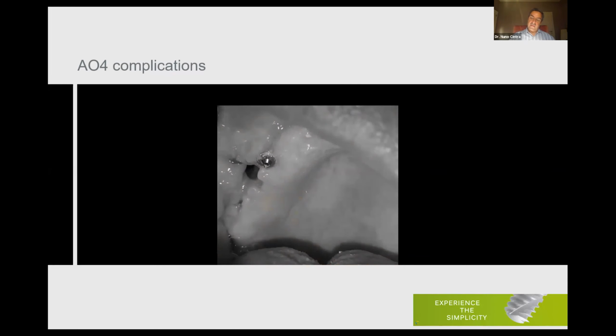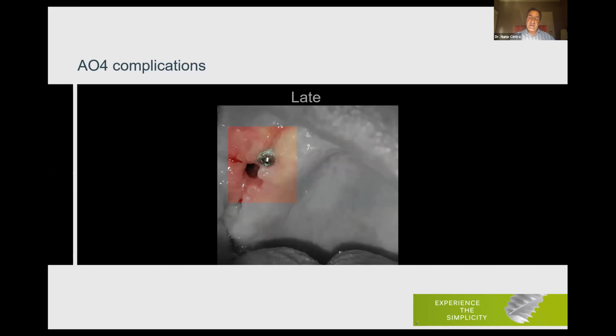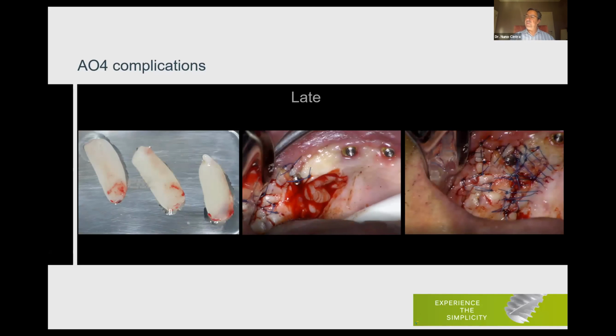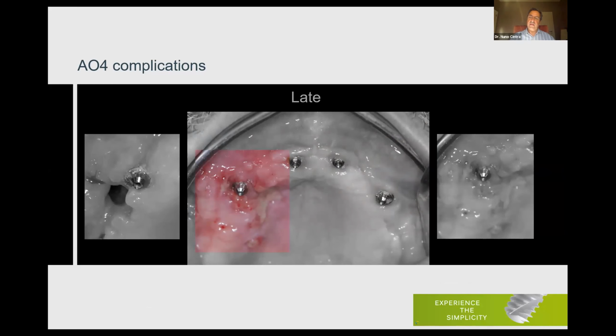But anyway, 1 month after, we were not able to close the communication on the right side. So this has become a chronic communication, and so we decided to go for a palatal rotation flap, bringing the artery with the flap, rotating it towards the communication, suturing it, and leaving the donor site healing by second intention. Of course, that's the part that gives more problems. So to avoid symptoms, we used PRF membranes. And as you can see, this is 10 days after surgery, the communication is closed. So from this to that with the rotation flap. So this is another complication that can happen, which is chronic sinus communications.